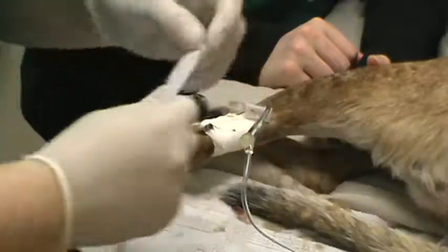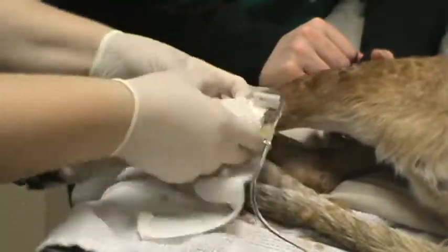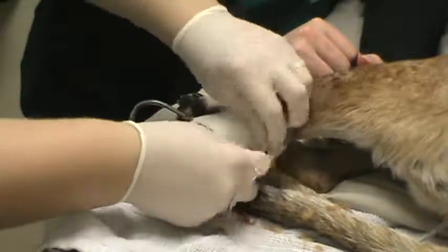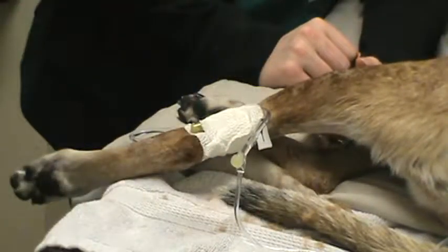Okay, so that's our vet wrap on there. So it's under hand. That wrap in place.